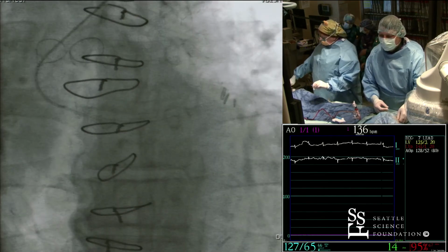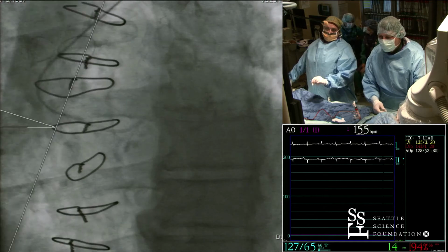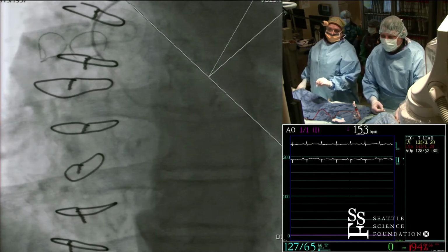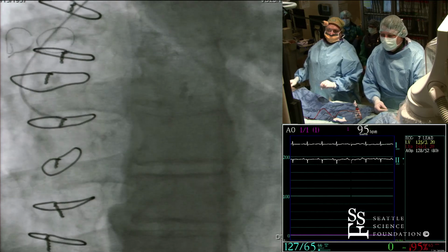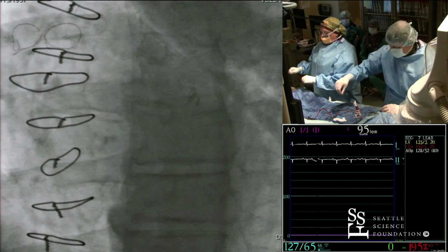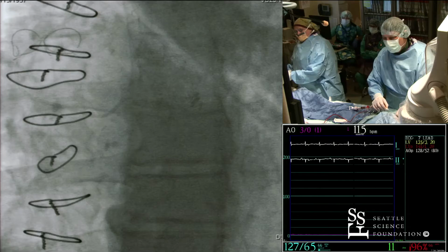You got a 15 LAO. Okay, so this is a JL4. We'll see if this will get in the left or not. I think the left's sitting right there. So there's two ways to look. We generally will do a JL3.5 from the left arm. It just needs a little shorter arm for some people. With aortic valve disease and a dilated root, then a 4 may work great.